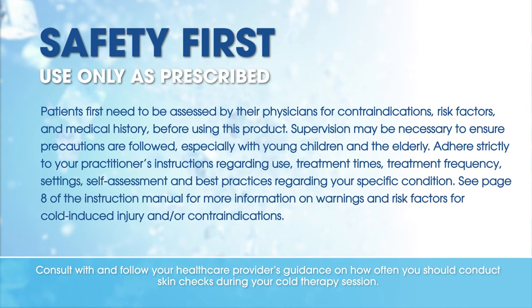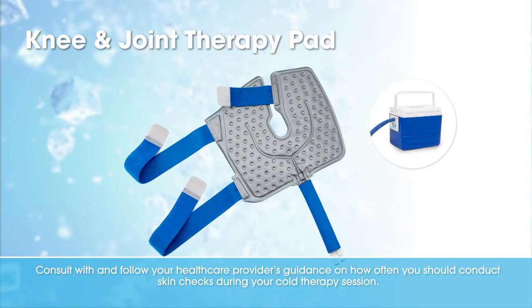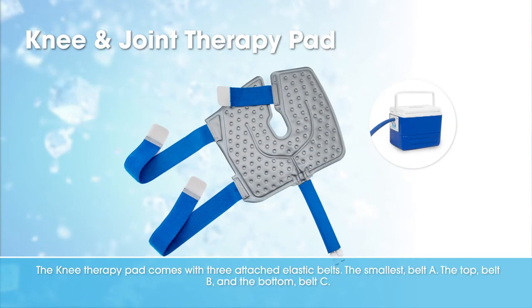Consult with and follow your healthcare provider's guidance on how often you should conduct skin checks during your cold therapy session. The knee therapy pad comes with three attached elastic belts.